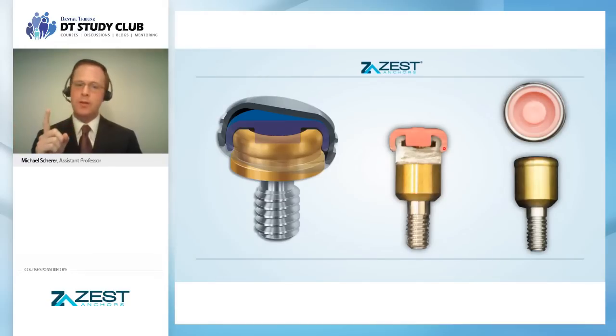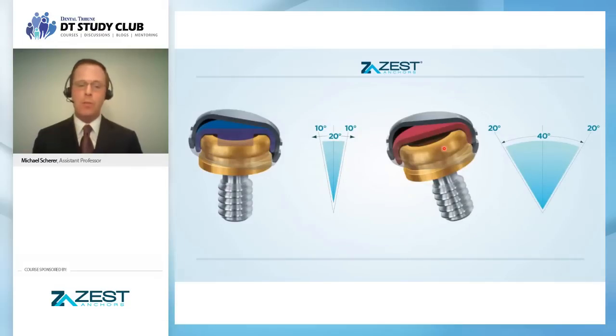And why is that important? Well, it comes down to the fact that when we think about how these things wear, the company has said, yes, the engineering is going to happen where the wear is going to be occurring between the top portion of the cap and not the inside portion or the business end. And that's why you don't tend to see a huge amount of wear of the actual nylon insert over time as compared to some other types of attachments.